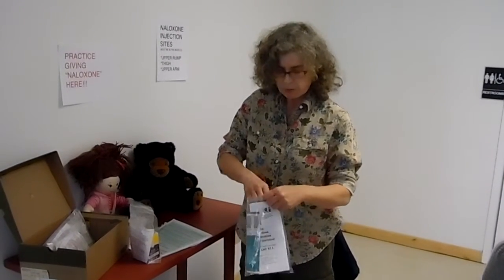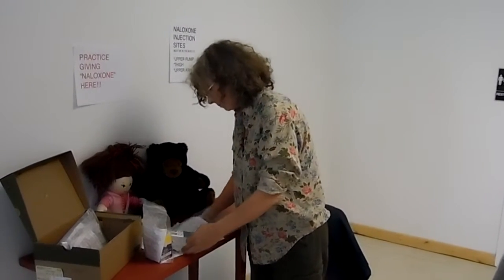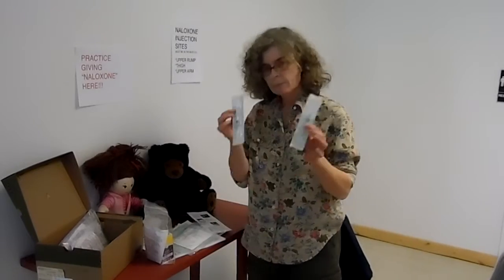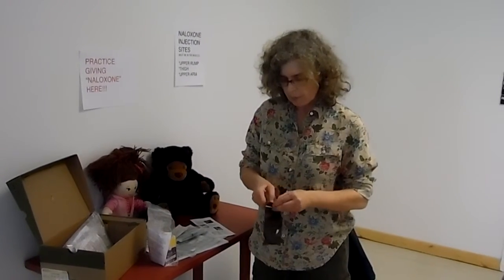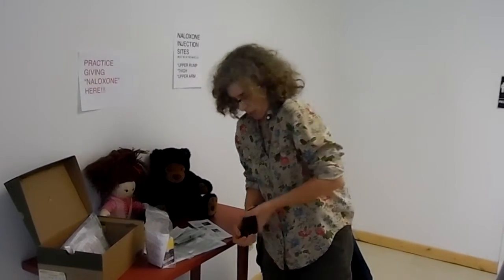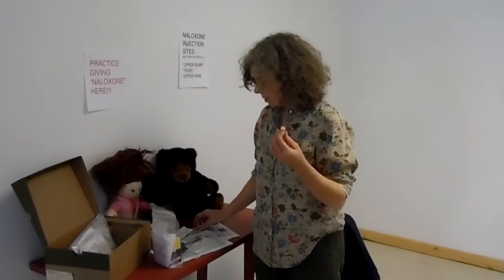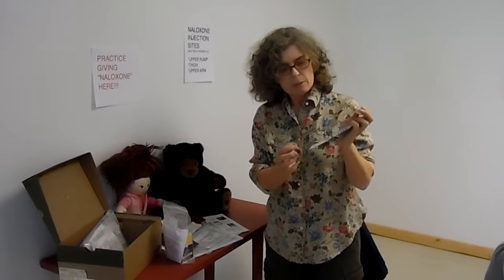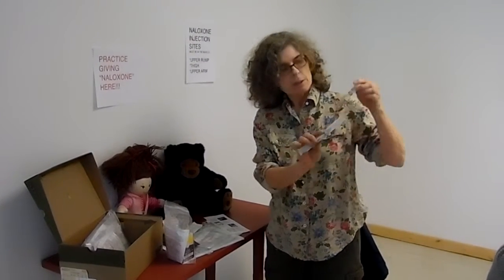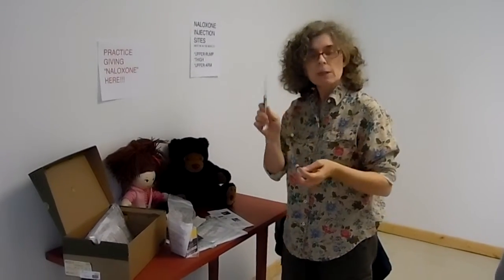This kit has two syringes in it — two of these in here — and they're empty. In this bag are the actual doses: two little bottles that you would normally use. You would take the cap off the needle, insert the needle, pull back the plunger, and this would fill with naloxone.